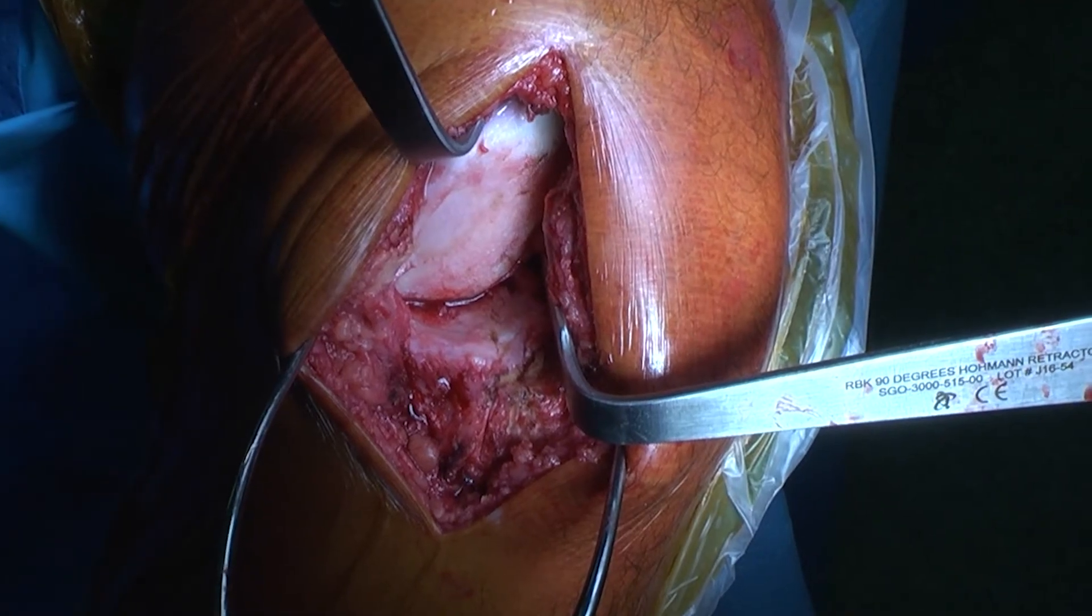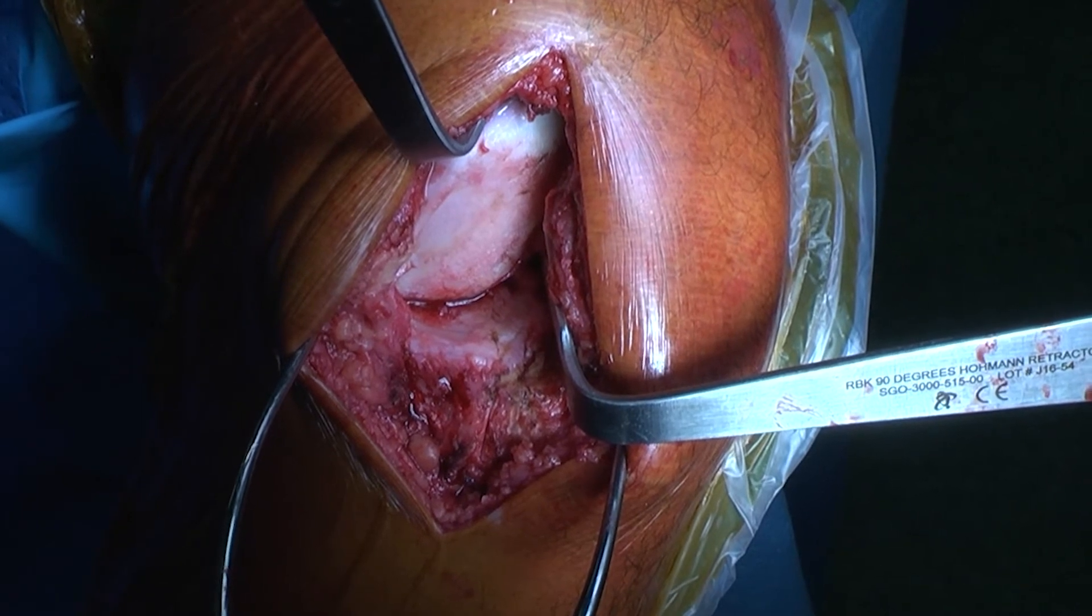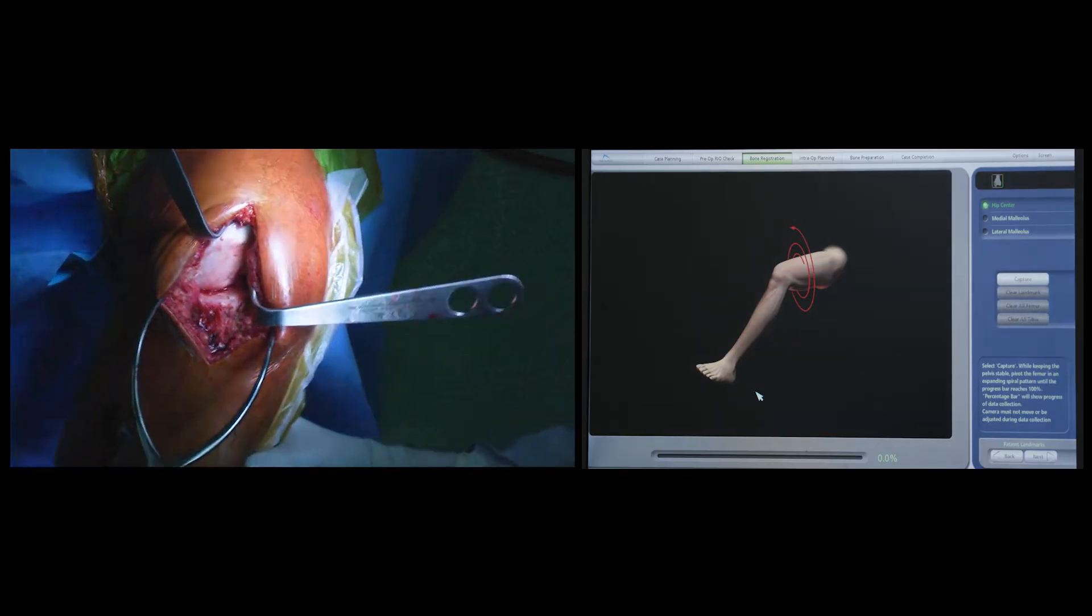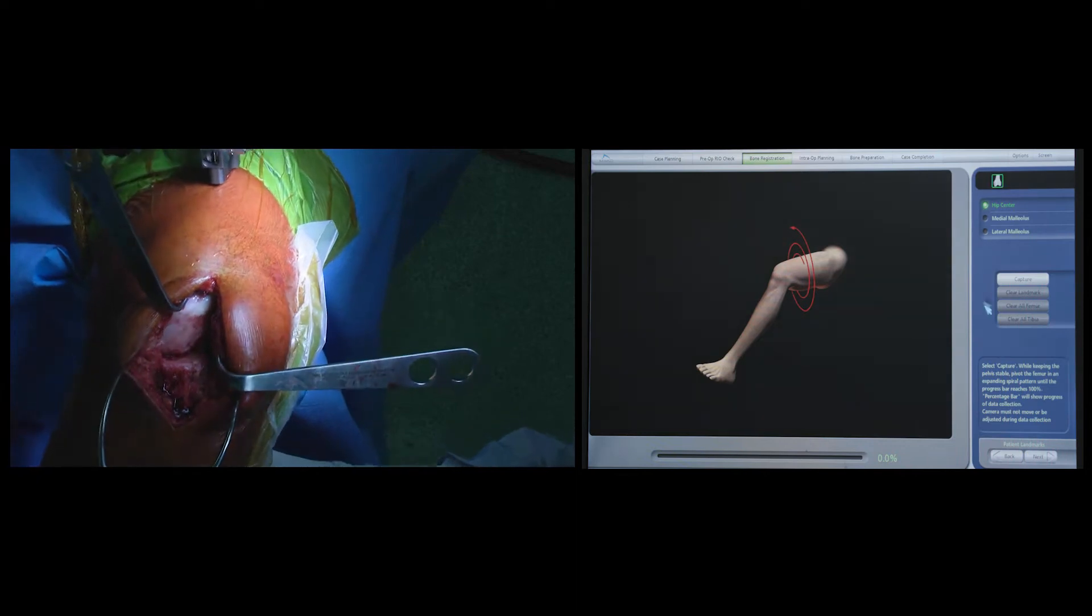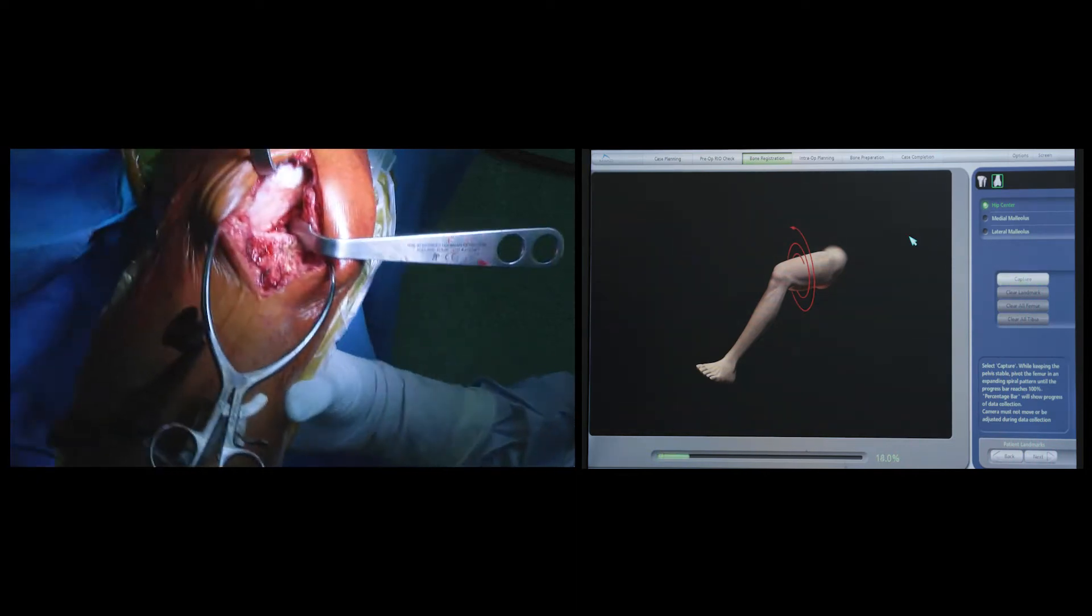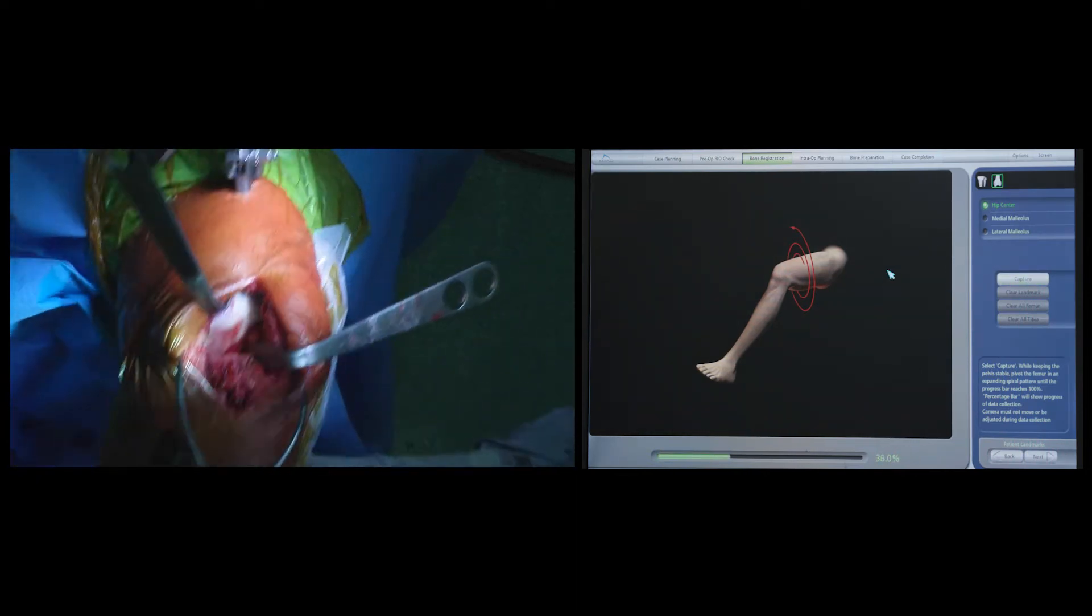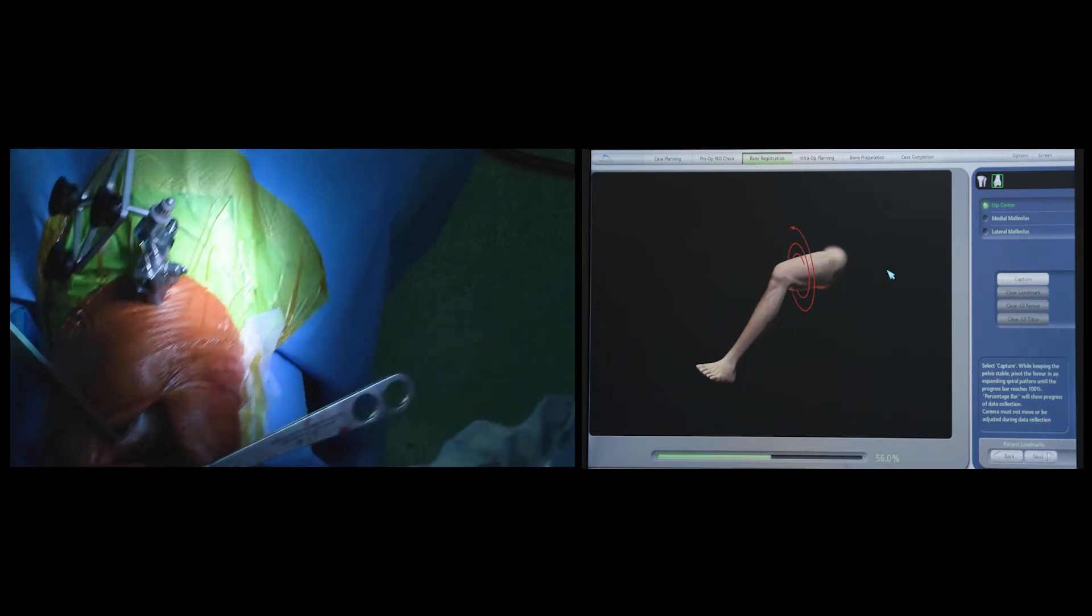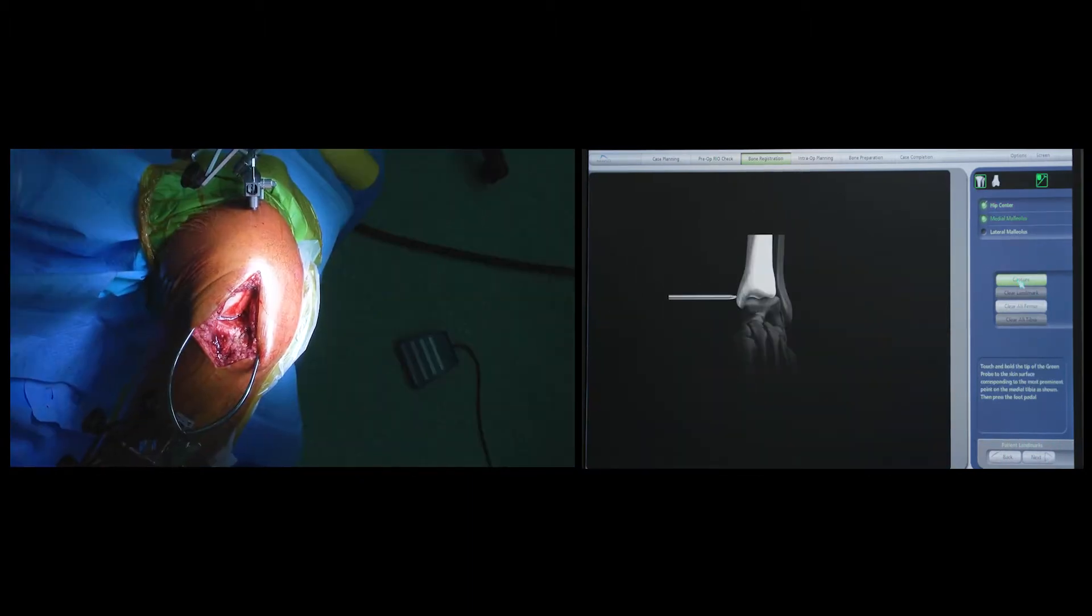Once I'm happy with the exposure, the next step is to register the center of the hip and center of the ankle. This is done by putting the hip through a range of motion and documenting the position of the medial and lateral malleoli using the pointer.